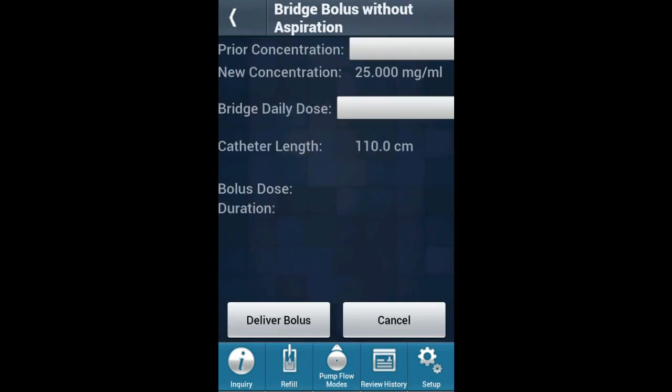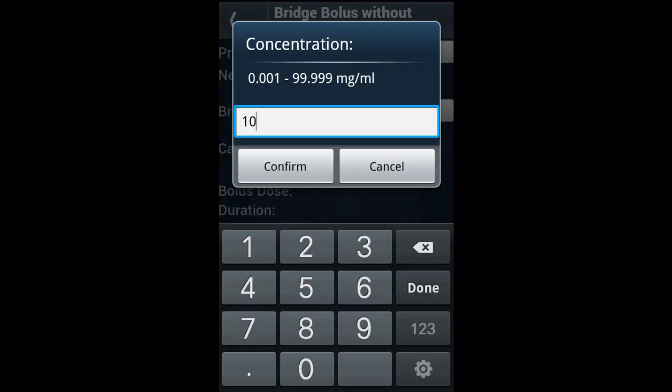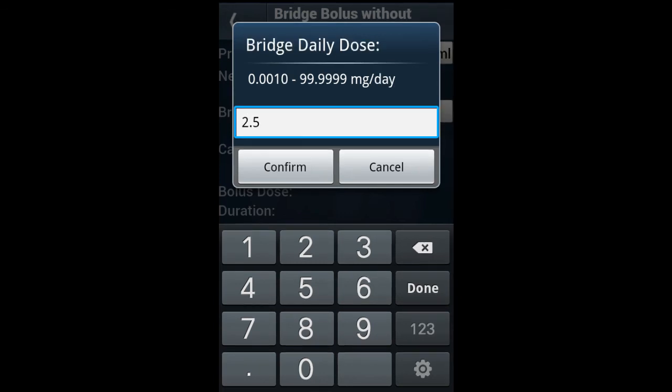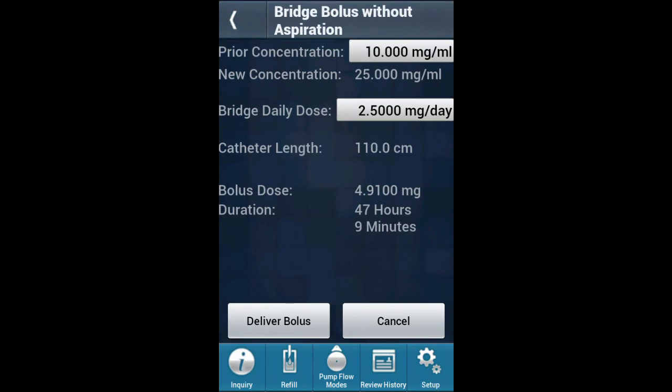Here you will enter the prior concentration and the Bridge Daily Dose. Prior concentration is the concentration of the old medication, and the Bridge Daily Dose is the dose that the old medication will be delivered at. After the values have been entered, the Bridge Dose and Duration will auto-populate.